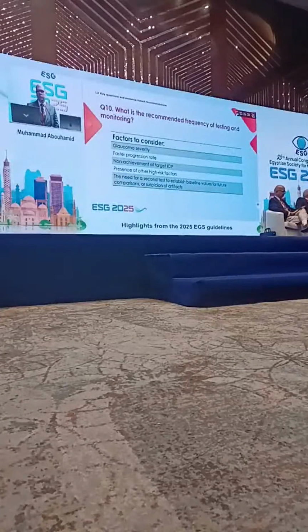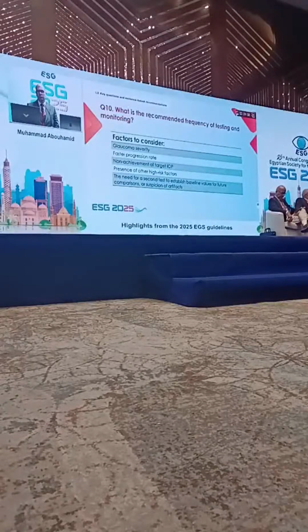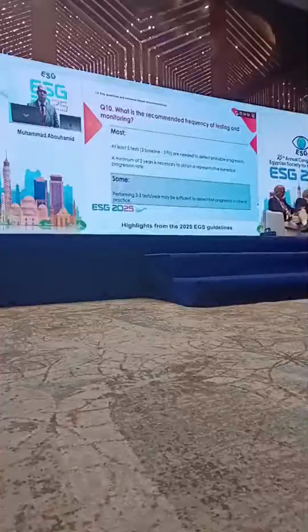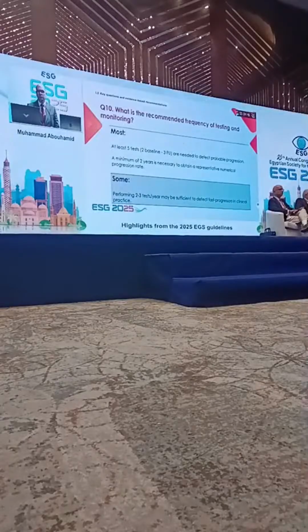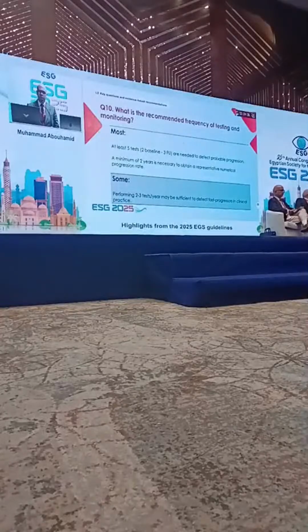With regard to frequency of testing and monitoring, these are factors to consider: glaucoma severity, whether the patient is a fast or aggressive progressor or not, whether the target IOP is achieved, and whether there are other risk factors. And we might need a second test just to confirm this finding. Most clinicians will consider that to detect progression, we need at least 5 tests, 2 baseline and 3 follow-ups, and to obtain a reliable numerical progression value, we need at least 2 years. However, some clinicians might think that performing 2 to 3 tests per year could be enough to detect fast progressors.